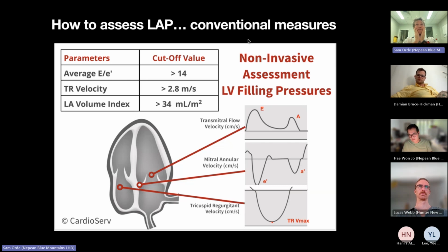I think you've got to make sure that she's got adequate afterload, and hence the worry I had with giving her the anesthetic. If you tank her afterload with septic shock, that can make the gradient worse. That's all I was meaning. So I think hemodynamic stability is really precarious in that patient, which is why repeated assessment with echo is just beautifully suited to that patient, both heart and lung.